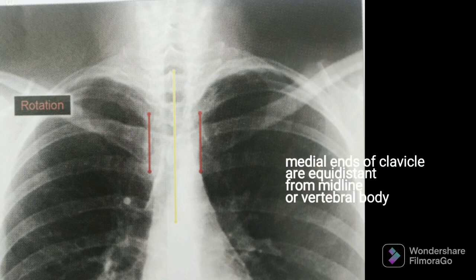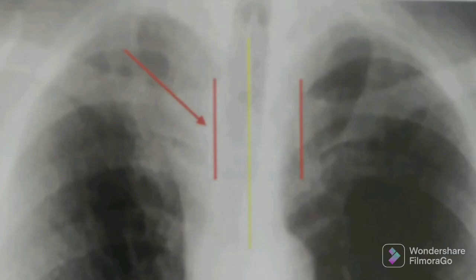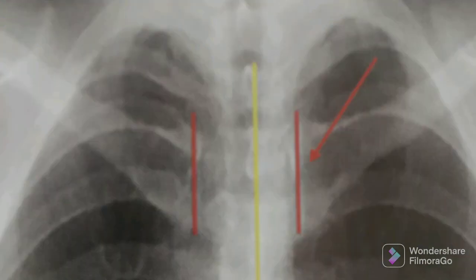Talking about rotation in a chest x-ray: the medial ends of the bilateral clavicles are equidistant from the midline or vertebral bodies in a normal chest x-ray. In a rotated film, the spinous process midline — shown by a yellow line — appears closer to one end of the clavicle. If the midline is shifted towards the left side, that is a right-rotated film.